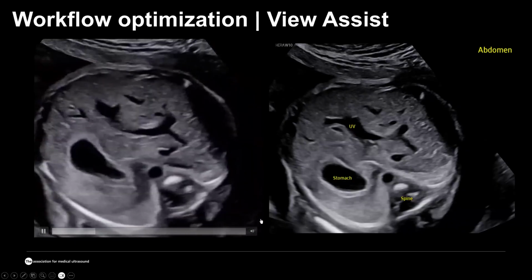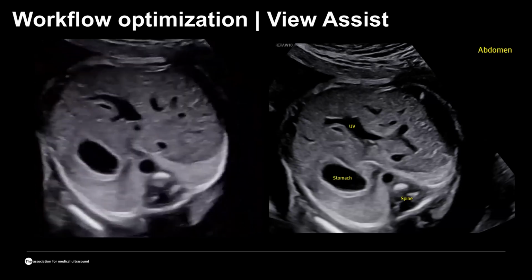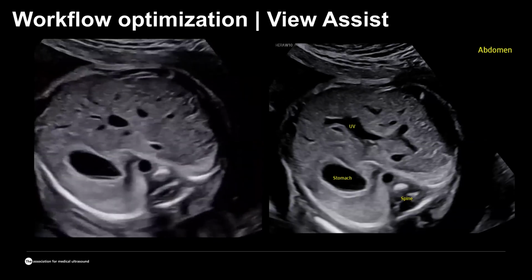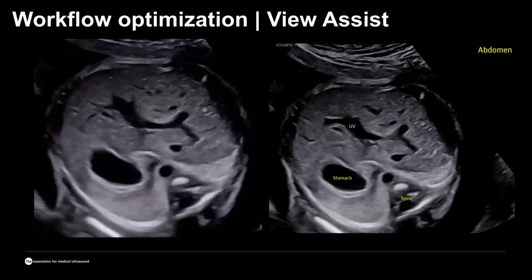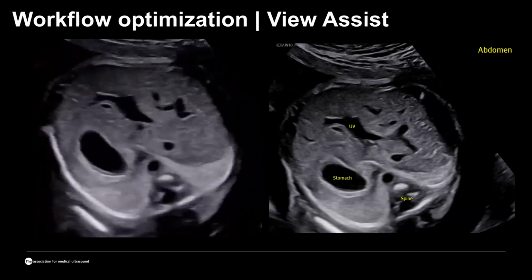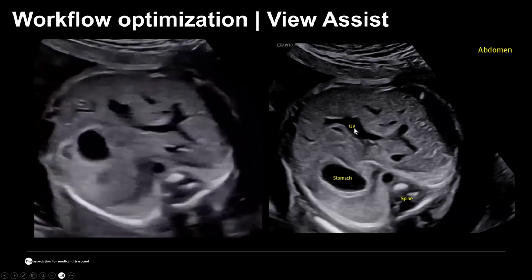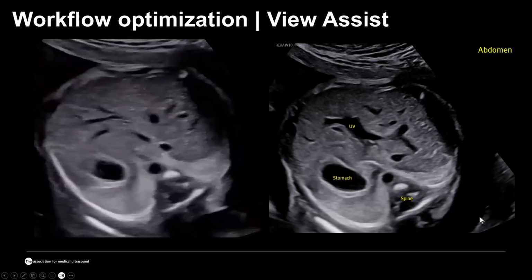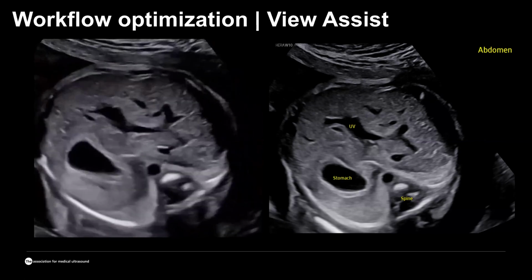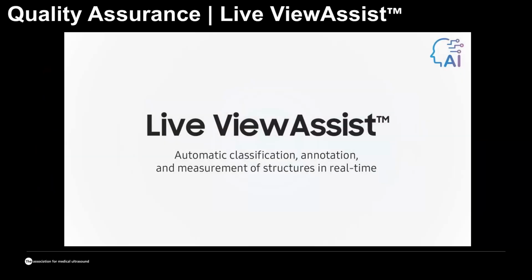And once you freeze and ask your personal View Assist program to put the auto annotations, that is performed automatically. So you know that this is the abdominal circumference, the reader of your exam knows why this picture was taken, and then you can see the umbilical vein labeled, the stomach, and the spine. So that is really important, not just for the person who performs the scan, but for those who read them too.